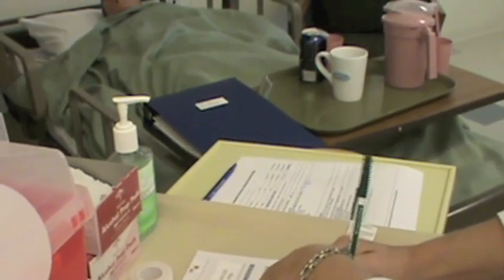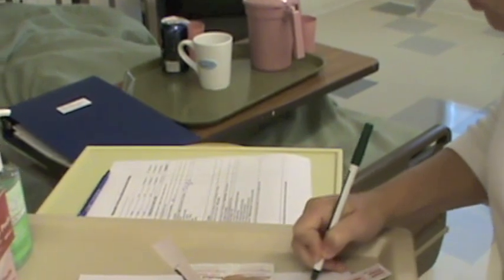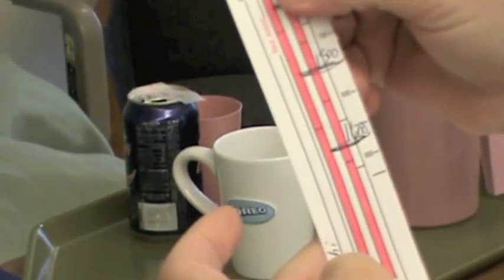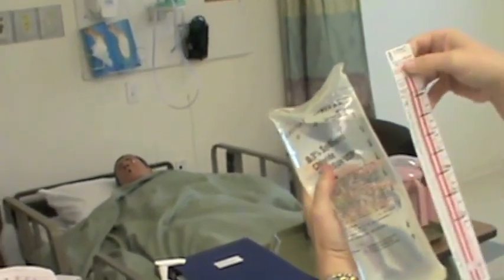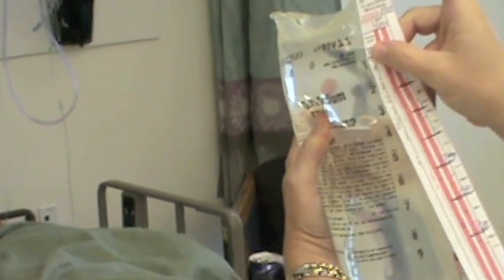This tells me whether my rate is staying consistent as the bottle empties. I'm starting this at 0900, so at 1000 I should be at the first line, at 1100 the second line, and so on. I'm writing those times and anticipating the bag will be due to be changed at approximately 1700. This sticker goes on the side — I never want to cover the contents label. I line up the first line with the arrow at number 1, then I can see, for example, I should be at a certain level by 1100. Now I'll hang the solution.